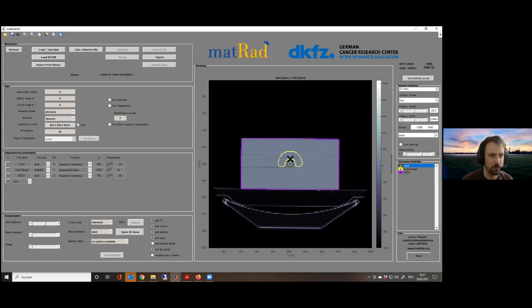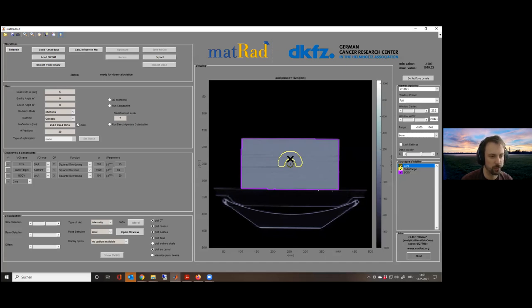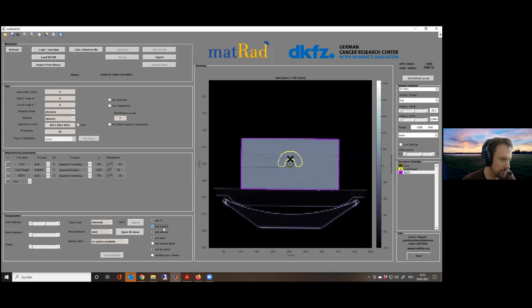This is one of the most sensible color maps for looking at a CT — bones become white, air becomes black, and soft tissue is gray. This phantom is a water box, delineated as a violet contour, which you can turn on or off in the structure visibility panel. The structure names and their colors are listed there — you have a core structure mimicking an organ at risk, and a yellow target structure.